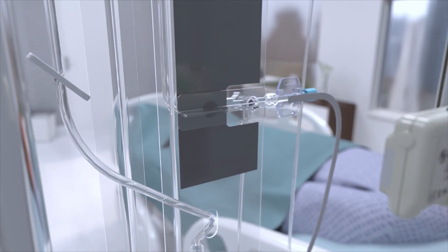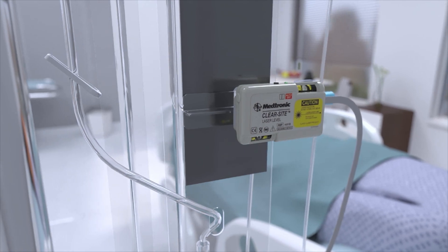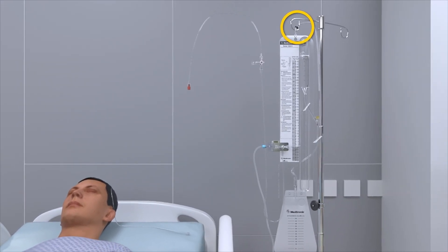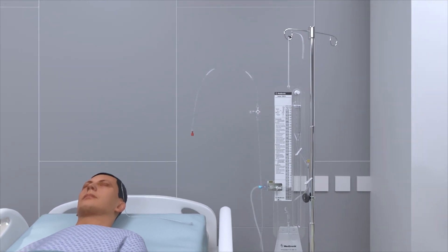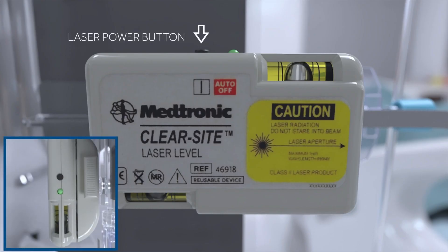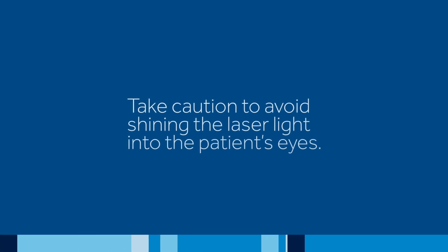Clip the ClearSight laser level onto the bracket on the back of the Becker system. Raise or lower the Becker system by squeezing the black cord lock and lengthening or shortening the cord so that the ClearSight laser level is roughly in line with the patient's head. Turn on the laser by pressing and releasing the black power button. A green LED indicates the laser is turned on. Take caution to avoid shining the laser light into the patient's eyes.